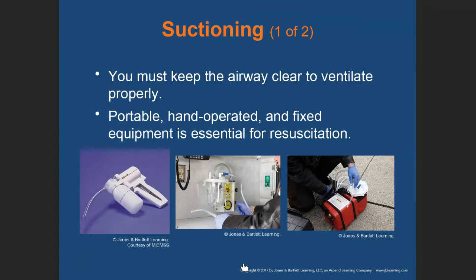So we do not start an assessment if we're approaching a patient and hearing gurgling sounds with LOC. We have to clear that airway first. You don't want a patient talking with fluid in the mouth. So if you hear gurgling or bubbling sounds, the first thing is turn the patient as a unit if you suspect spinal injury, or turn the head to the side, allow gravity to assist you, and get your suction device ready to clear that airway passage.